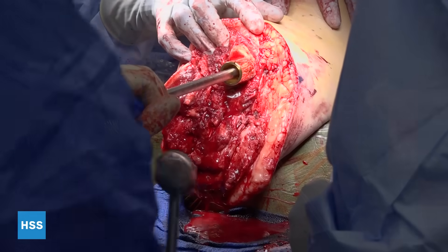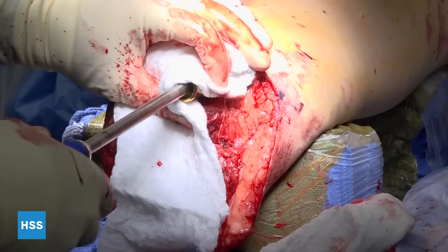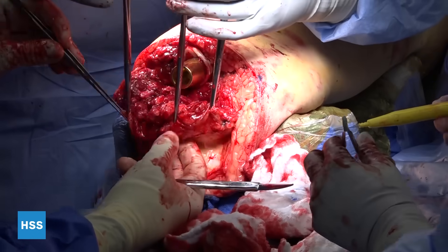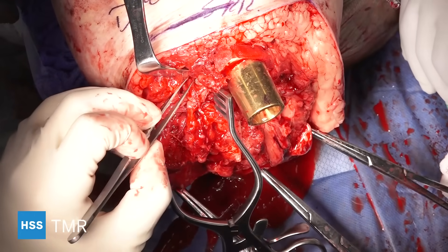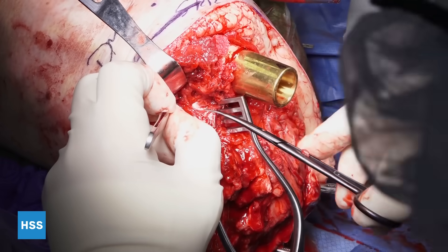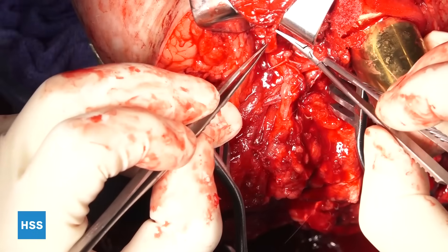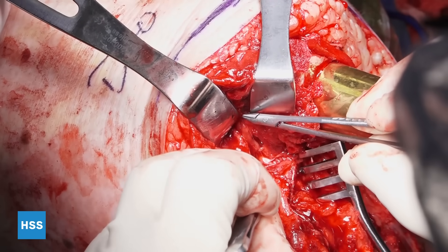The implant is impacted until it sits flush with the bone. The handle is then removed and the implant is in place. The next stage is some additional soft tissue surgery — we make sure we have the muscles separated from the subcutaneous flaps, and then TMR is performed. Basically the tibial nerve and the peroneal nerve are isolated and attached to an adjacent motor nerve for targeted muscle reinnervation. TMR is typically done after the implant is in place.